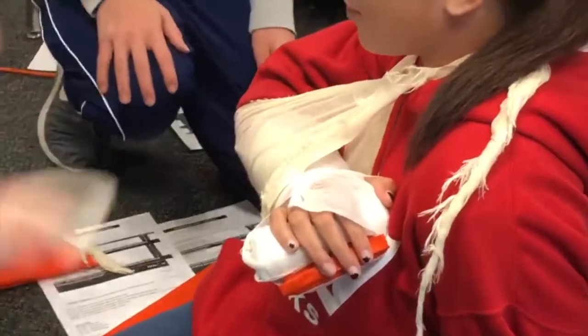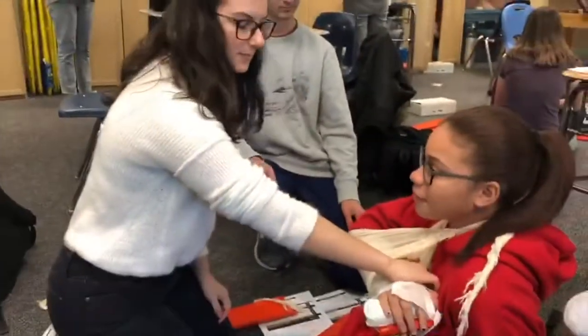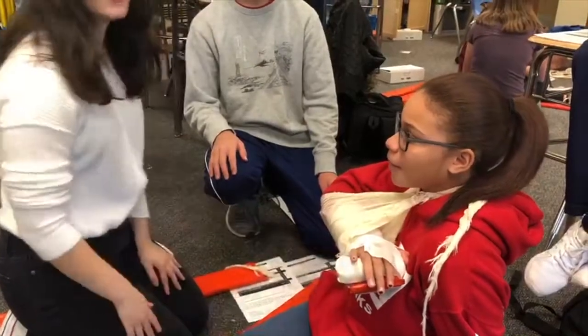Tie that there, and then again, just around the whole body. Then, obviously, PMS again — feel for pulse, move your fingers, good. What finger am I touching? Move the pinky — there we go. That is the radius ulna splint.